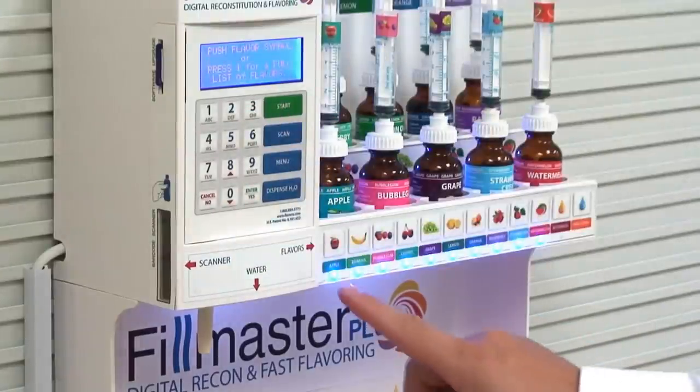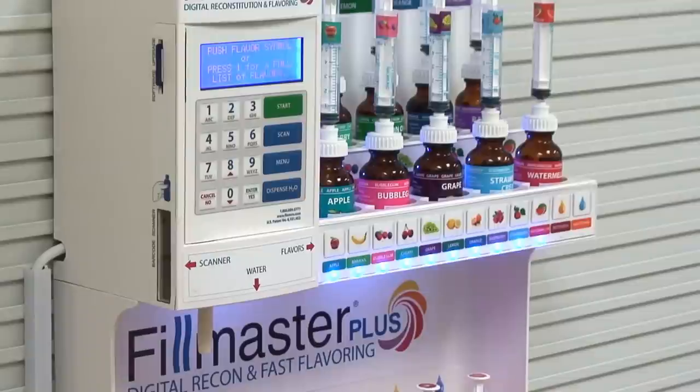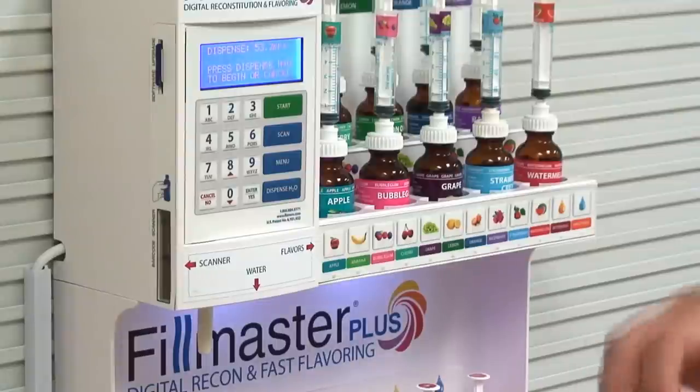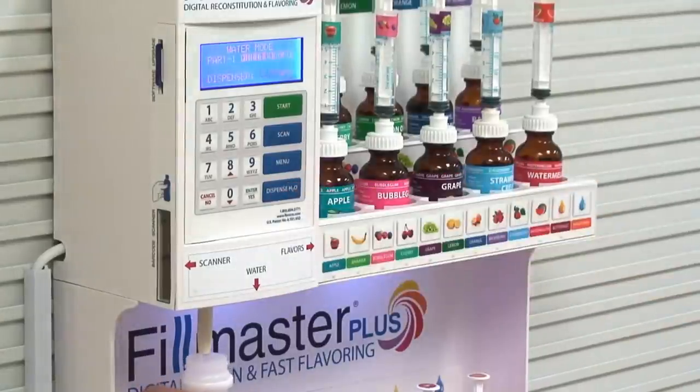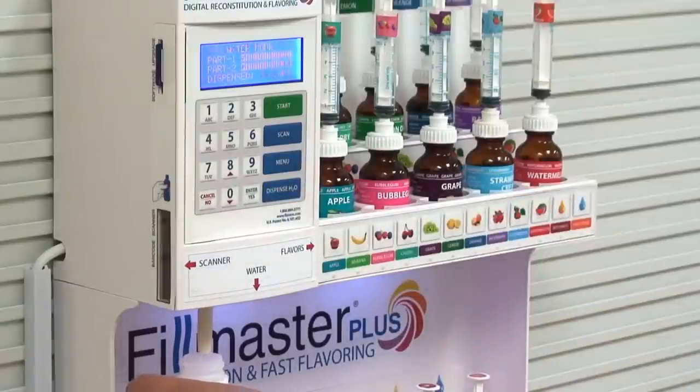The flavors that work with this specific medication will light up. In this case, we'll select bubblegum. Confirm you've selected bubblegum. The system will dispense the first half of the water required and pause for mixing. You will be warned if you do not dispense the second half of the water required. Press dispense again to complete the process.